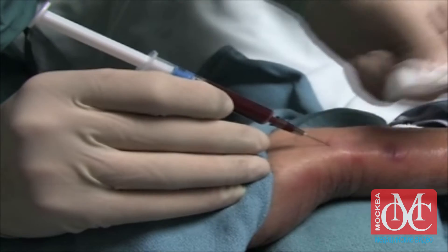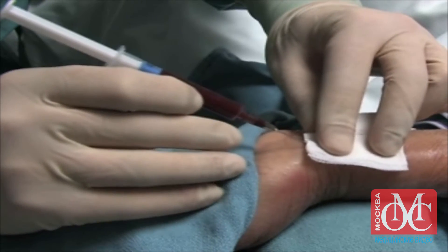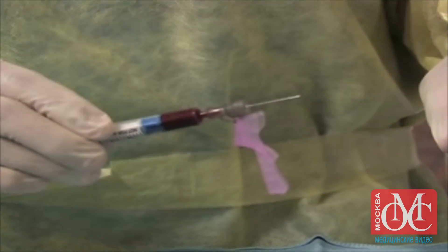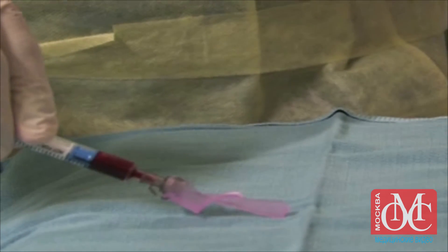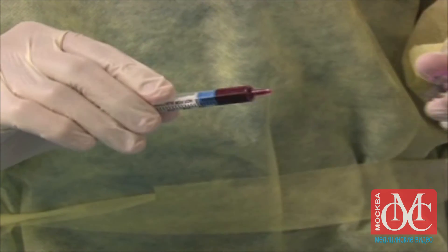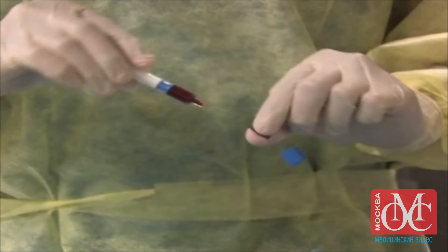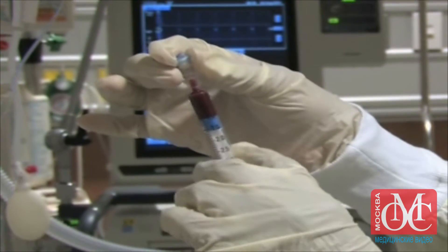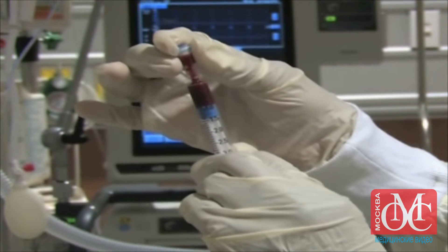After the blood sample is collected, withdraw the syringe and have an assistant apply pressure to the site with sterile gauze for approximately 5 minutes. In the meantime, expel the air bubbles from the syringe. Cover the needle with the attached safety cap and remove the needle from the syringe, or remove the needle from the syringe using the rubber stopper. Attach the heparin-containing cap and, while holding the cap in place, push the plunger of the syringe to ensure the blood encounters the heparin. This will prevent the blood from clotting.